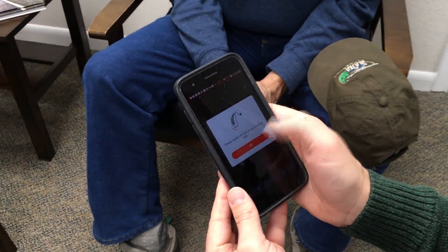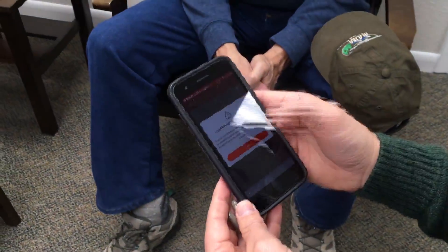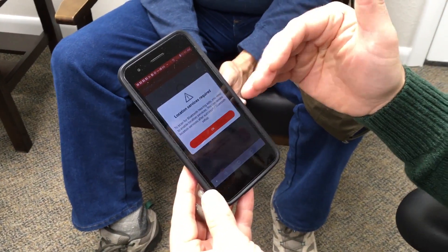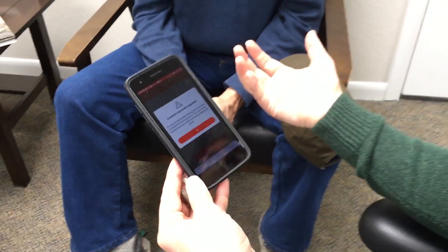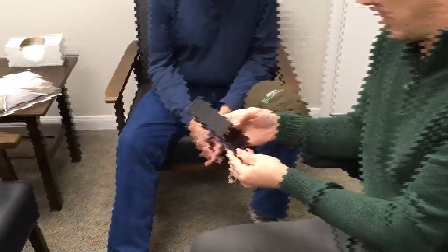In order for Bluetooth to work, it's asking for location services. This isn't so it can track you or anything like that. The phone has really good information in it — if the hearing aids can look at the GPS on the phone and see that you're going 50 miles an hour, they know they should probably be in car mode. By using some of the data on the phone, it helps the hearing aids make better decisions about how to help you understand the world around you.